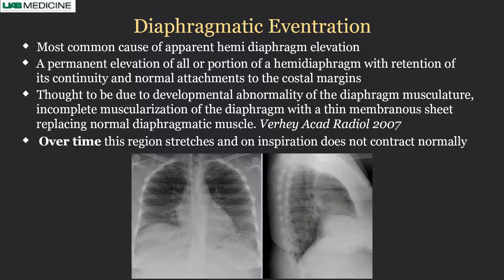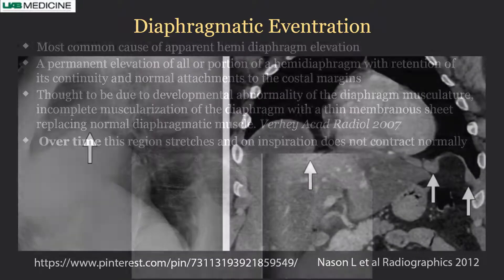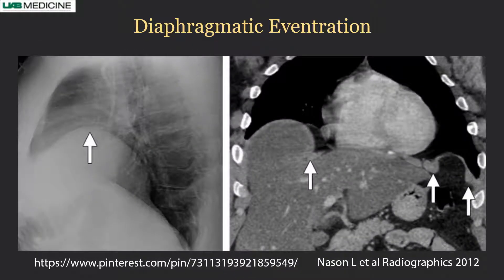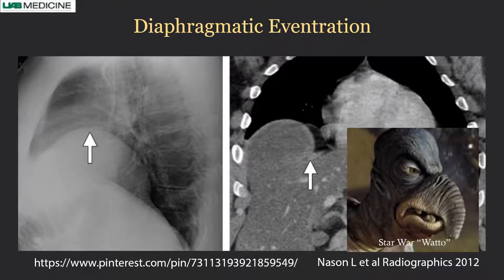Here is a patient with elevated right hemidiaphragm. On the lateral view, the anterior portion of the diaphragm is elevated while the posterior is not. This is a case of partial eventration, which is more common than complete eventration where the entire diaphragm is eventrated. On CT you can see part of the liver protruding into the chest.